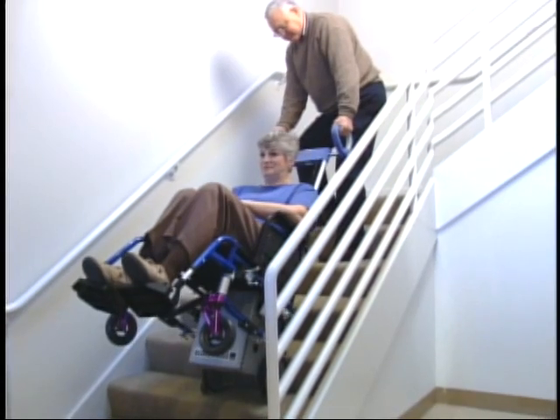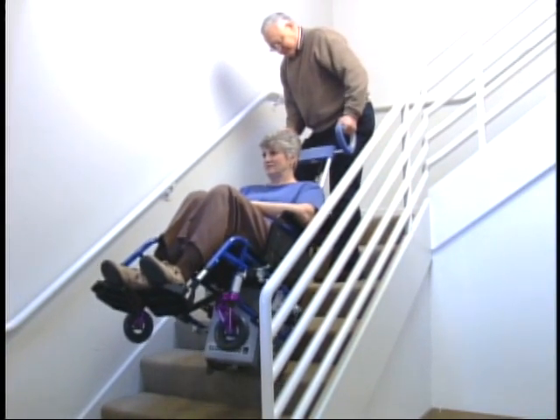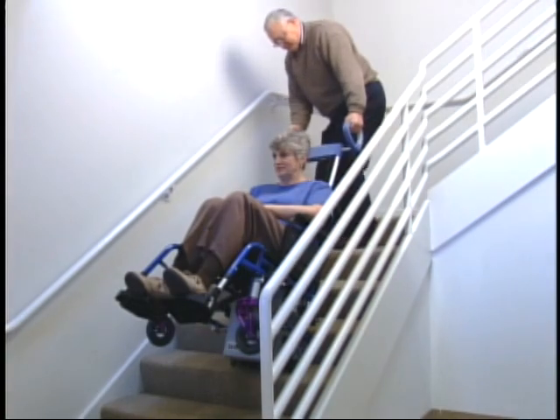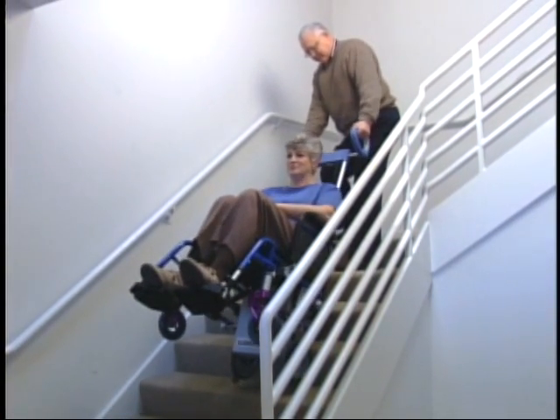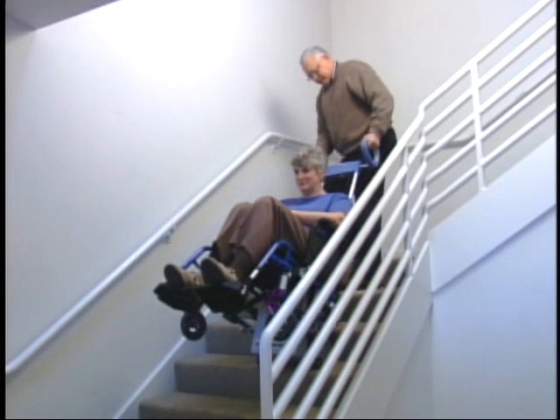The Scattermobile is a motorized stair climber for manual wheelchairs. With Scattermobile, your own wheelchair becomes a stair climber that can ascend or descend up to 30 flights of stairs on a single battery charge.